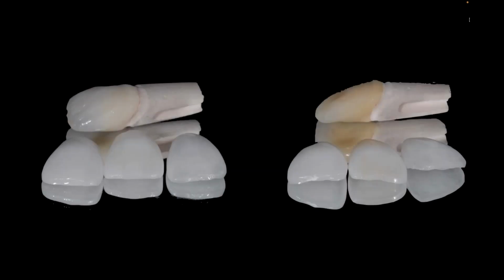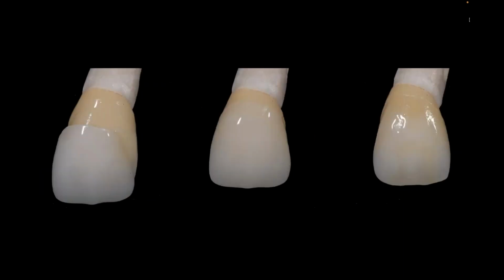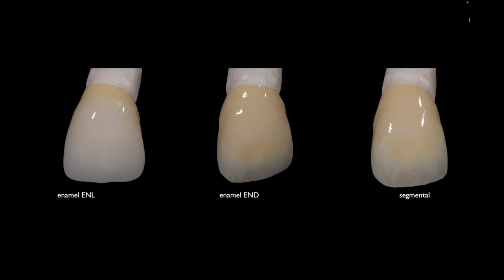So if I take these same veneers now and I put them on these 2 different colored teeth that I've made, and you can see that they're 2 completely different colors, it's kind of interesting to watch. And by the way, just to be clear, I put a little bit of a glazing medium inside the veneer. This is where when I put it on, you get that bond between the 2 materials, so you really see the coloring underneath. And notice what happens as I slide them on. Look at the enamel over that darker surface. It really masks a lot of it. You see a little color coming through, a little warmth, but realistically, you see a much whiter, brighter surface.